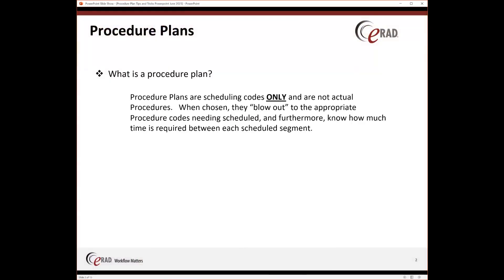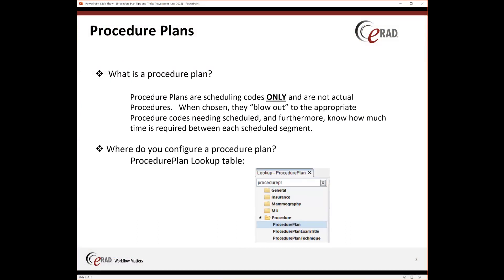So, what is the procedure plan? Procedure plans are actually scheduling codes — they're not actual procedure codes. Basically, what they are is a plan that involves two or more procedures within them, and when scheduled, it blows out those exams into the scheduling module. It also knows how much time is required between each one of those exams. When you're configuring your procedure plan, you're going to go to the procedure plan lookup table.